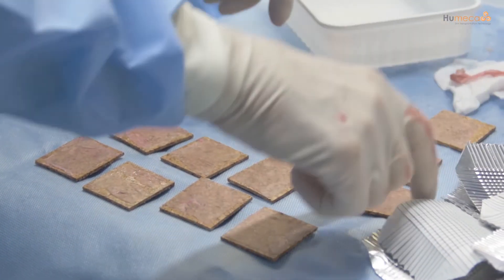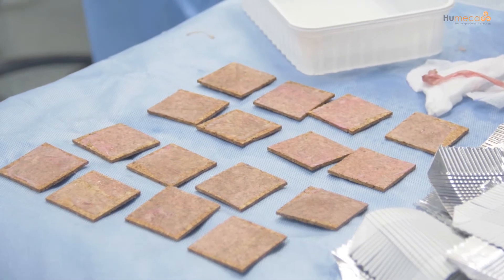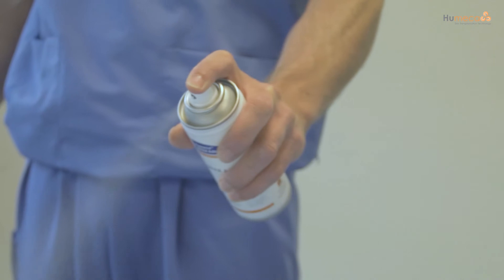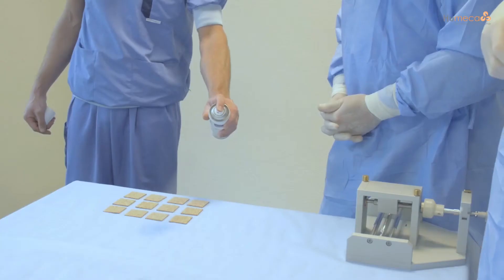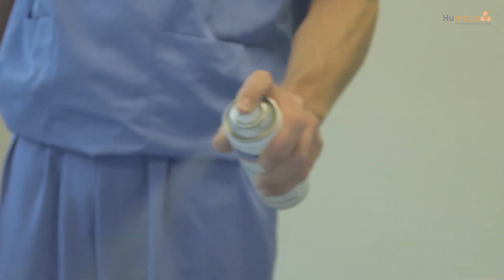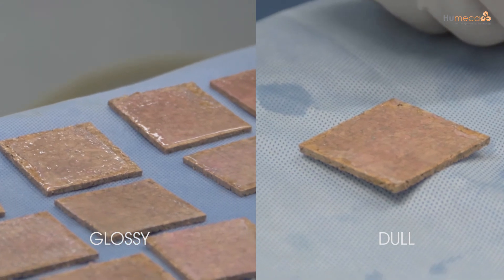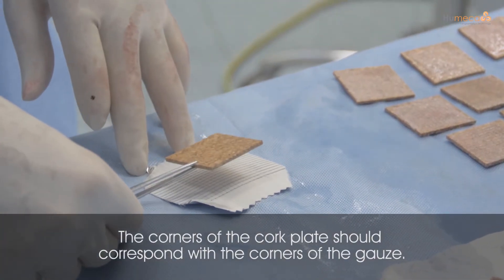Place the cork plates with the skin on a flat sterile surface covered with a sterile drape. Put the cork plates a certain distance from each other and set them away from other items to prevent them from getting sprayed as well. Spray the epidermal skin evenly with adhesive from a distance of 20 to 25 centimeters. Be careful that the force of the spray doesn't cause them to fly off the edge of the table. Do not spray too much, and allow adequate drying time of at least six minutes, but always wait until the surface changes from glossy to dull. Set a timer and make someone responsible for monitoring the time.